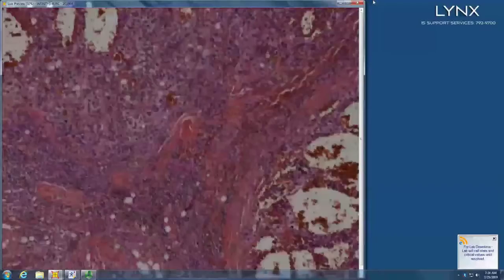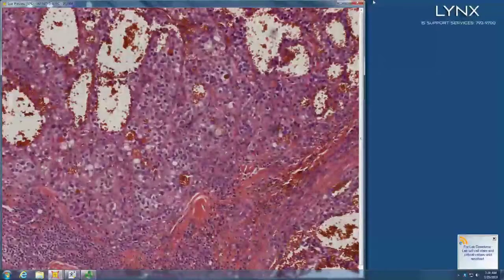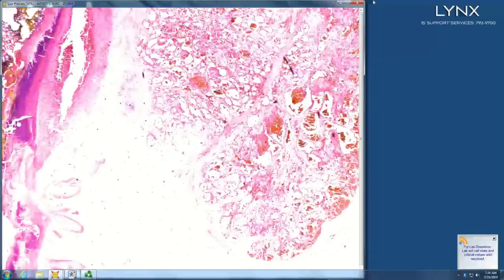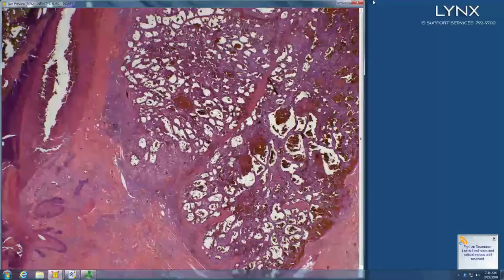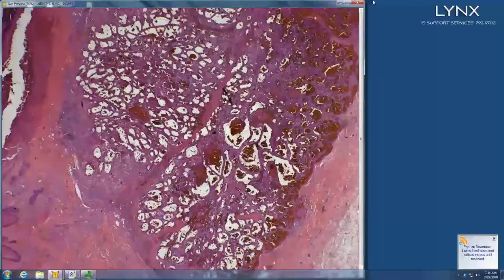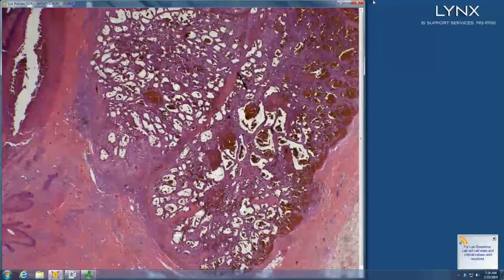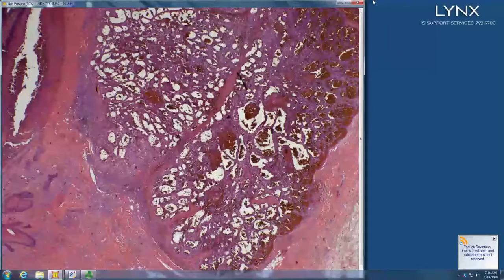So, are those sebaceous? Looks like vacuolated. Yeah, so kind of clear tubules, lots of blood. It was like a glomeruloid hemangioma. So it looks very hemangioma at scan, doesn't it?